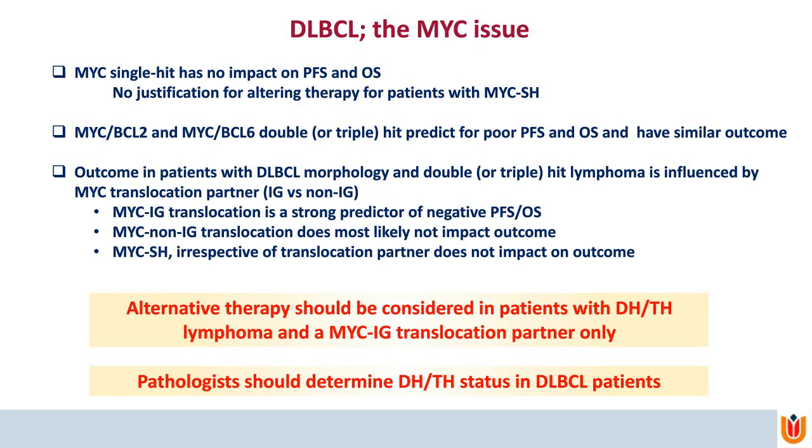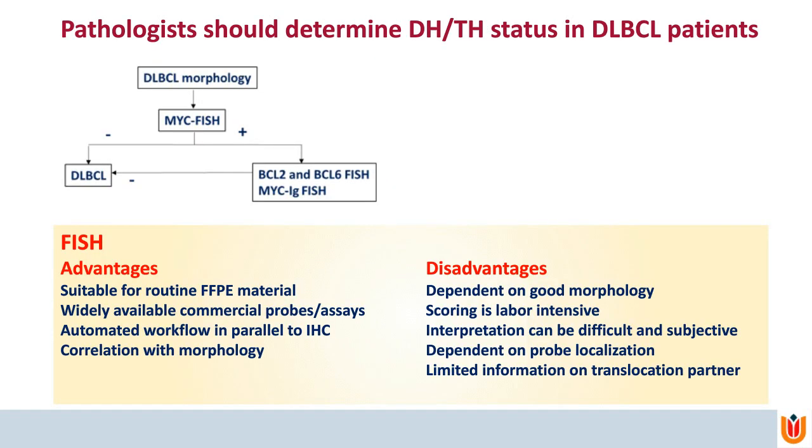It means that pathologists should determine this detailed translocation status. And that, as said, we routinely do using FISH, fluorescent in situ hybridization.